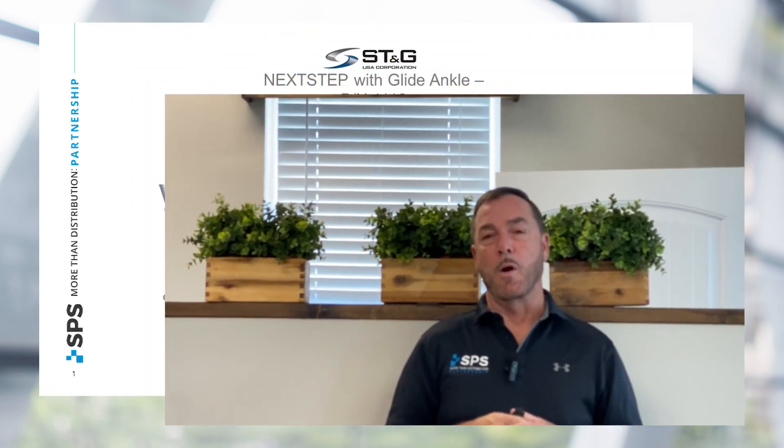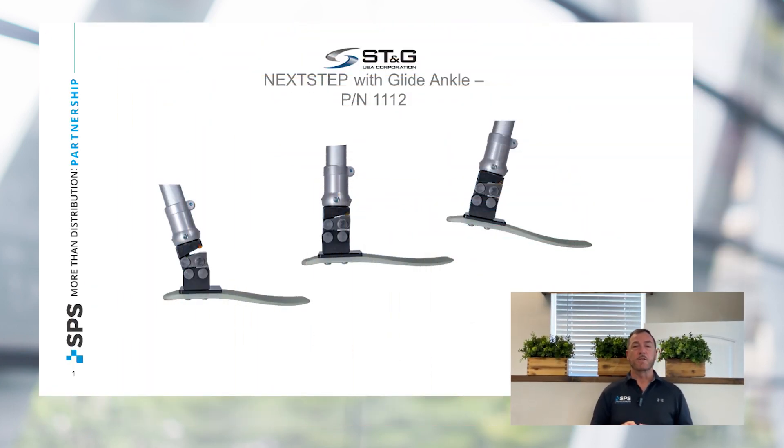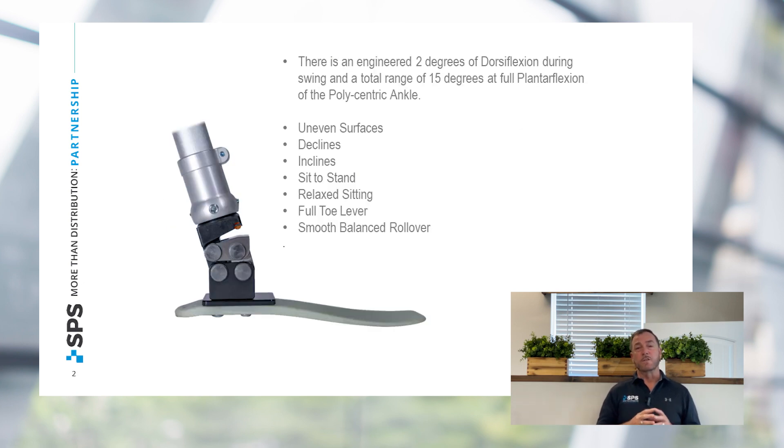This is relatively new to our market. It is a polycentric designed ankle system that allows for two degrees of dorsiflexion during swing phase and a full 15 degrees of plantarflexion. This has given us great control on uneven surfaces, on declines, and inclines.